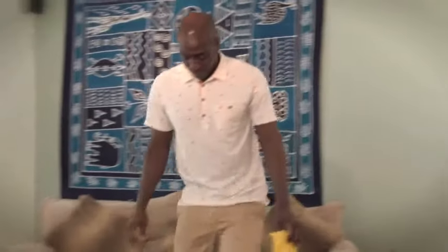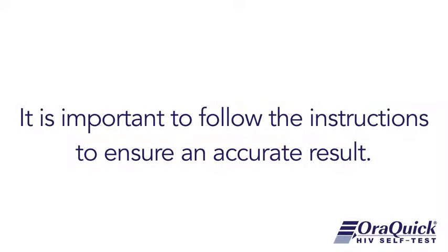This video shows you how to use the OraQuick HIV self-test properly. The test has been shown to be effective, accurate and safe to use. It is important to follow the instructions to ensure an accurate result.